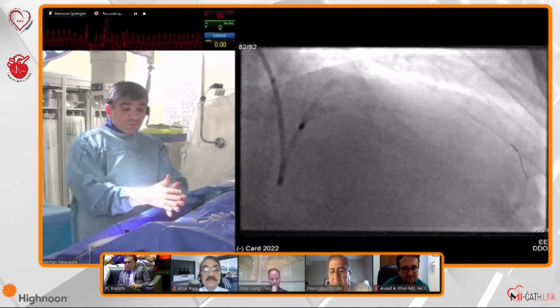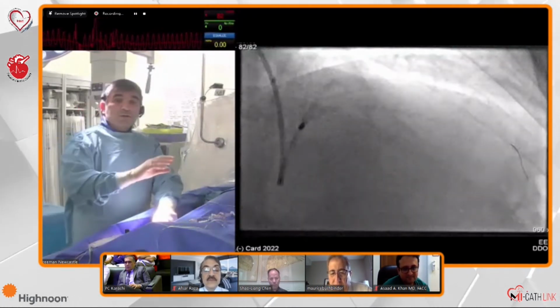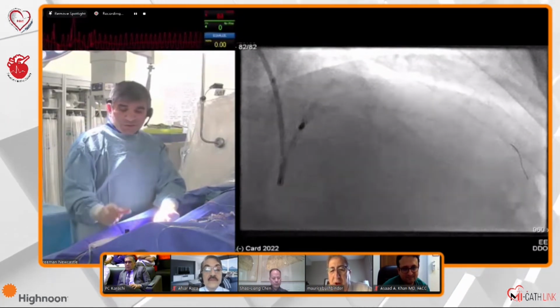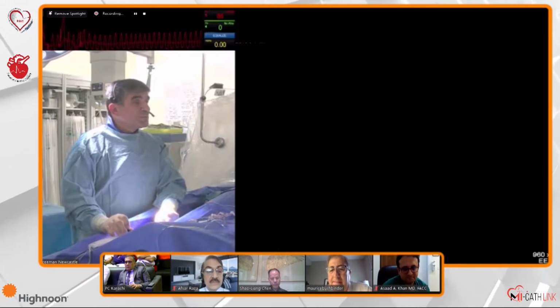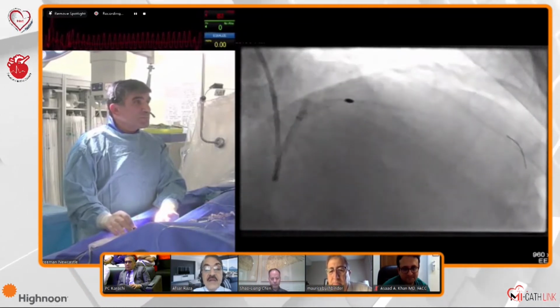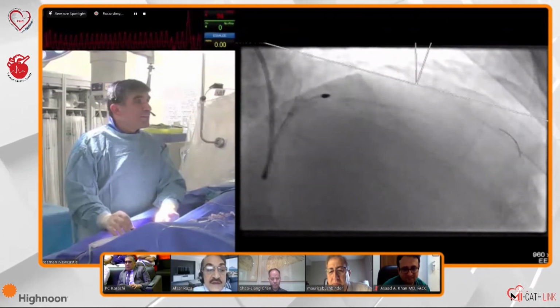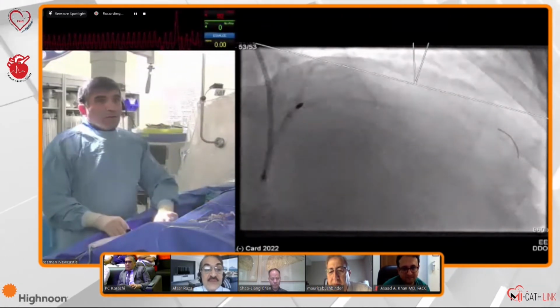If the patient is tolerating it, no bradycardia, everything is okay, you could burr a little longer. But doing this, you're 100% correct. So yeah. But sometimes the blood pressure drops, hypotensive. So are there any predictors to avoid hypotension?